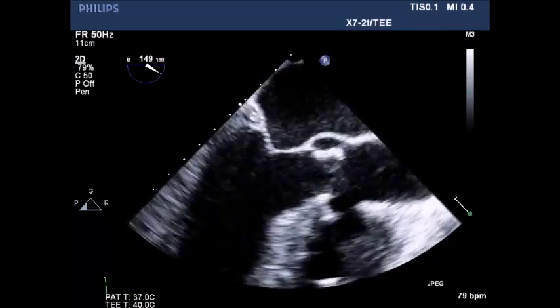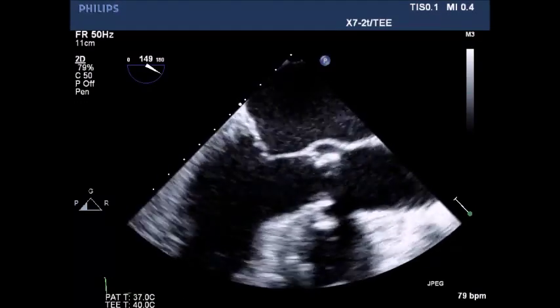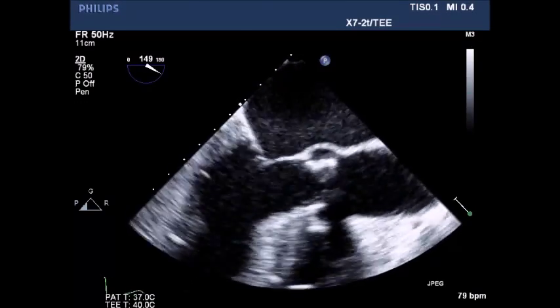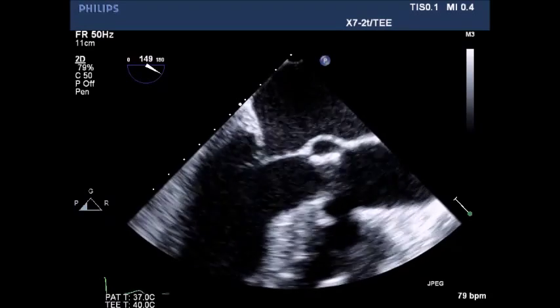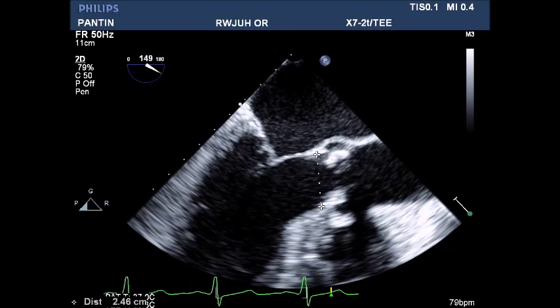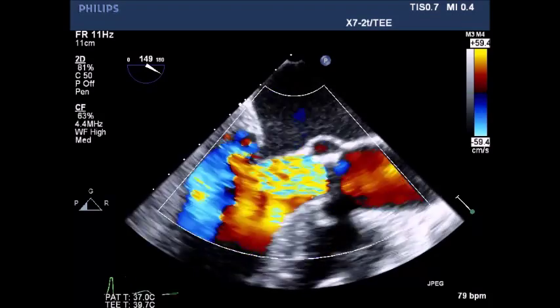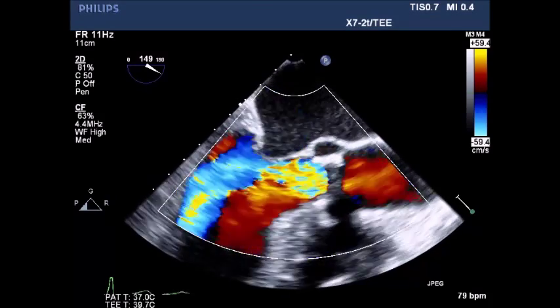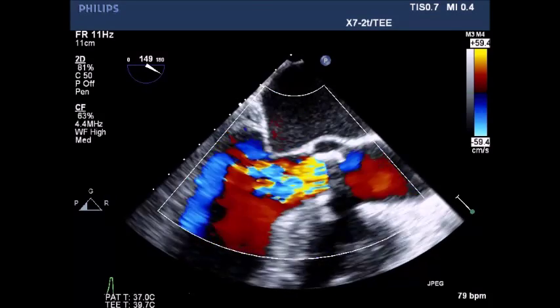Long axis view of the aortic valve with normal ascending aorta. LVOT diameter measured at 2.46 cm. Color flow Doppler shows severe aortic stenosis and aortic insufficiency — massive aortic insufficiency.